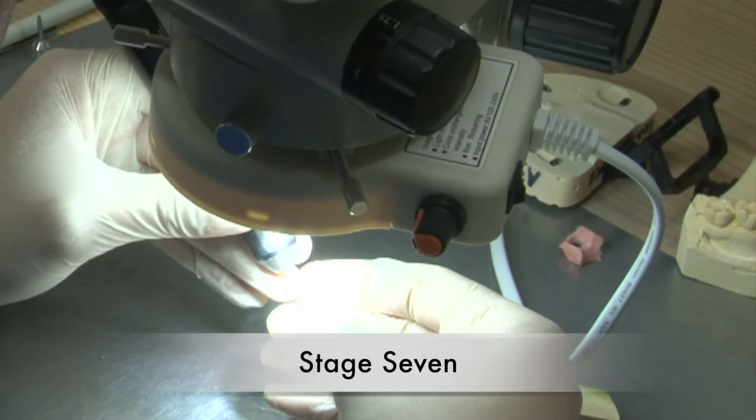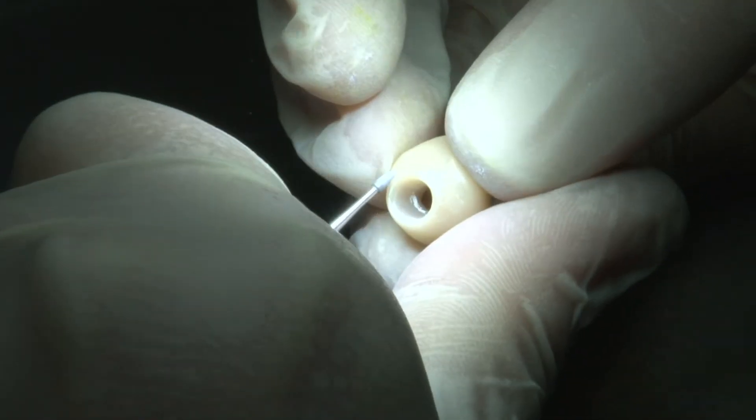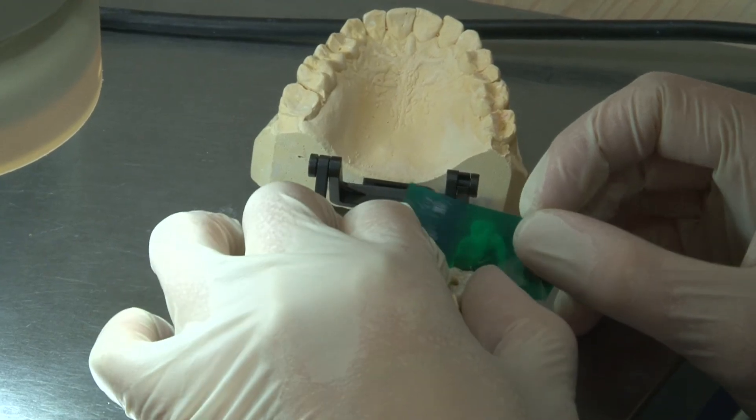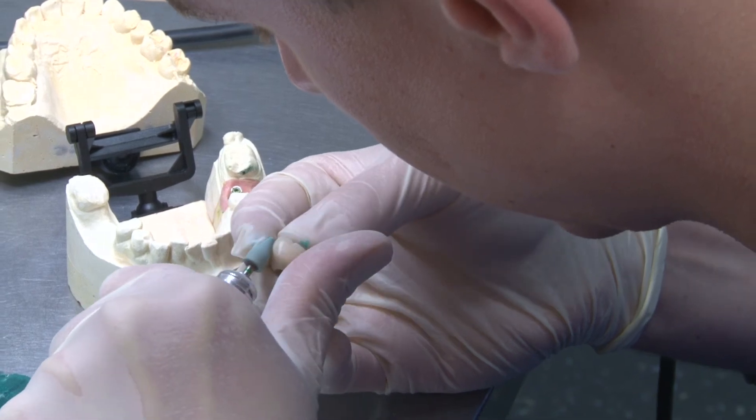The zirconia restoration is then fitted by the technician to the model with a prepared natural tooth or implant. It is then stained and glazed using special materials. In the final step, the restoration passes through quality control and is finally fitted.